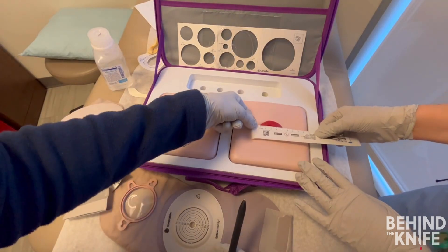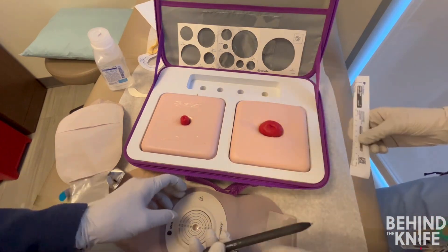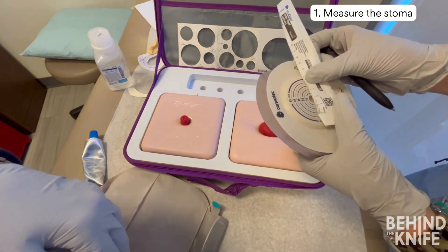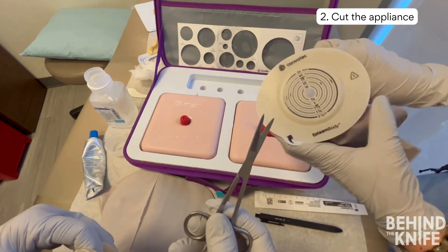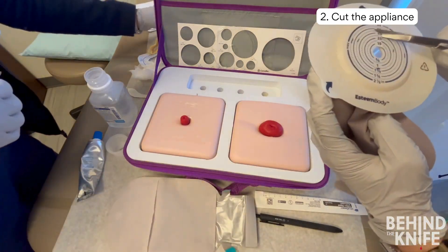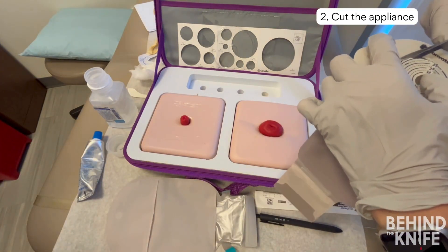To manage a prolapsed ostomy, it is helpful to use ostomy paste or an ostomy ring. You should cut a slightly larger opening in the appliance to allow the bowel room to expand as it folds onto itself during prolapse. If the opening is too small, it could lead to bowel strangulation. Unlike the rigid appliance, ostomy paste and rings are more flexible, enabling them to adjust and expand to accommodate the increased diameter during prolapse.